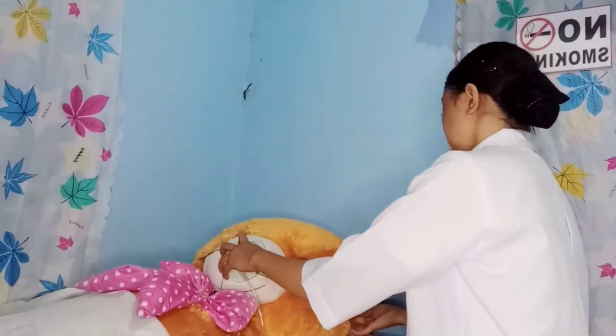Next, remove the mask and dry the skin every 2 to 3 hours if oxygen is running continuously. And lastly, do not use powder around the mask. Ma'am, tanggalin ko na po yung mask.